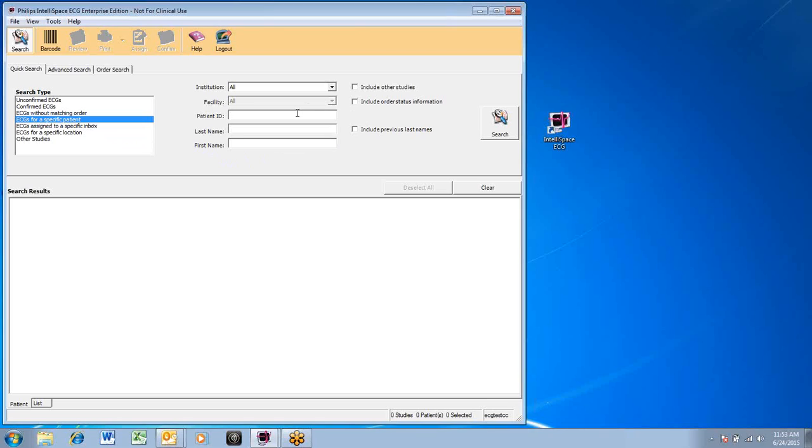Users can enter the MRN number or patient ID number, making sure you include preceding zeros, or you can use the patient's last name and/or first name to narrow down your search.